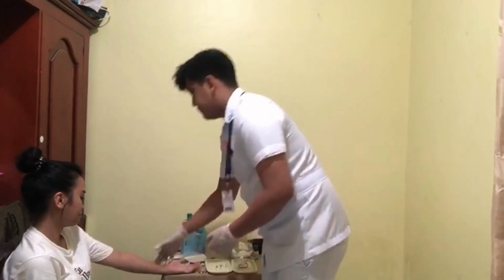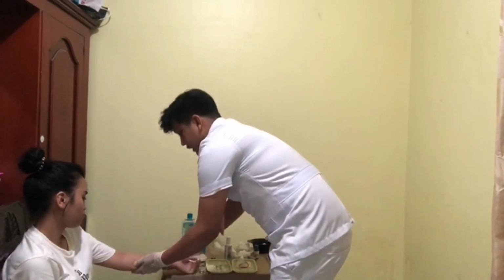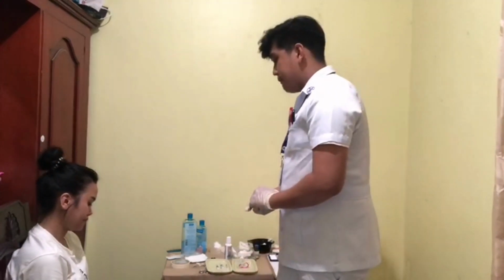After that, we'll now inspect the patient to choose an injection site free of lesions and discoloration. Ma'am, can I see your hand? Okay. Since the patient has no skin lesions, I will now position our client's arm on a flat surface, making sure that the elbow and forearm are supported and the client is comfortable. Are you comfortable with your position right now, ma'am?